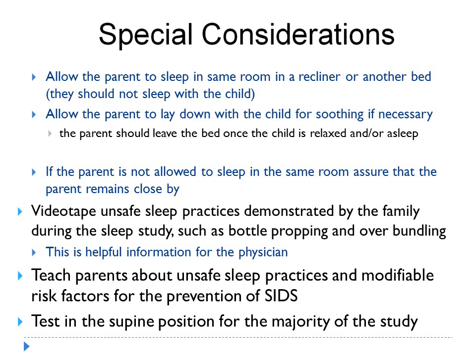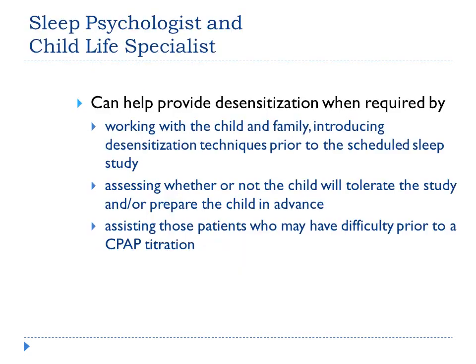You want to test the patient in the supine position for the majority of the sleep study, so you want to encourage sleeping supine as well. Let's go on to our next slide.